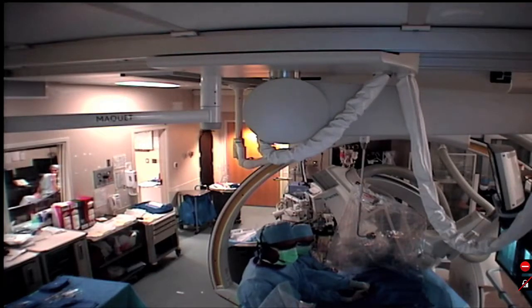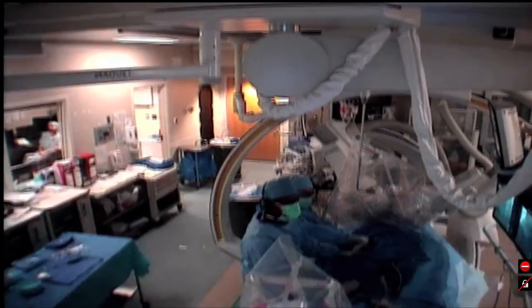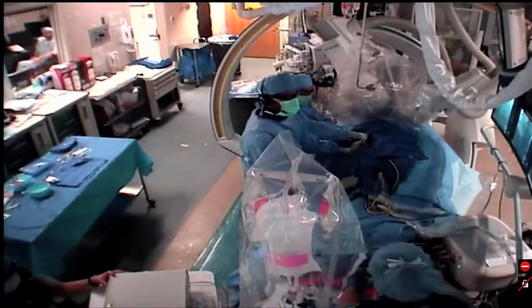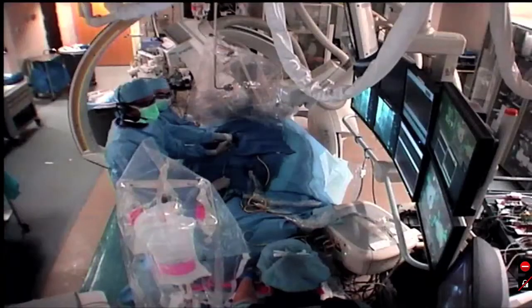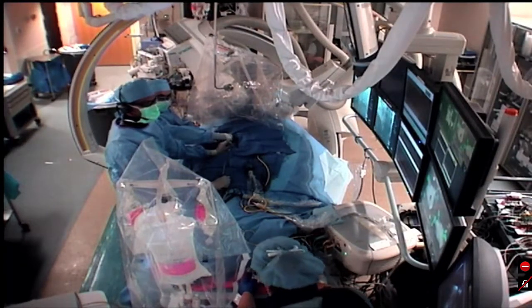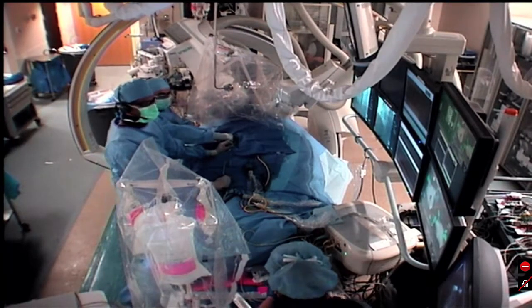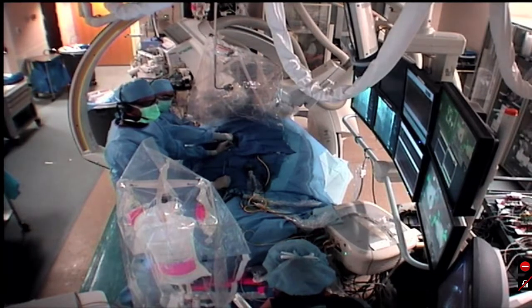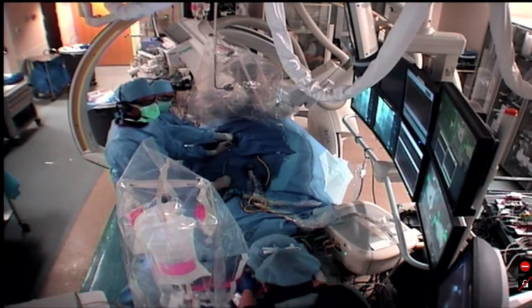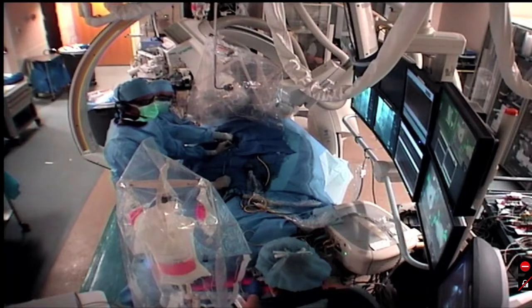Can I just ask, Pierre, using your ECGI mapping, when you find what you consider an AF source, how do you target that for ablation? What's your strategy? A very good question, because it's still unclear in my mind. But what we would most often do is to transect that with a kind of linear lesion. But it's really unclear what to do and what the best strategy is.